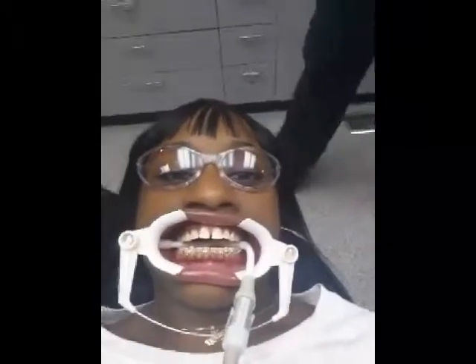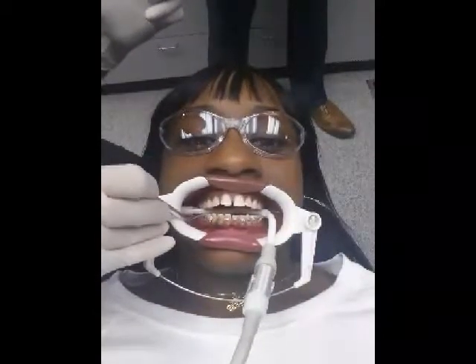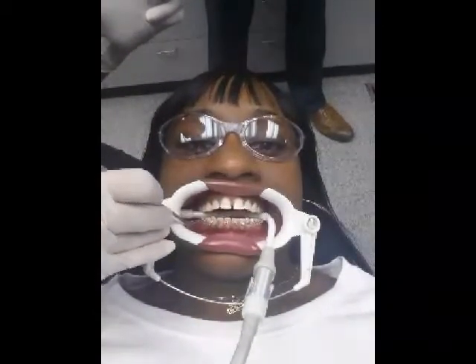And the orthodontist, who you saw for a minute, his shoes behind me, there he goes. He comes behind her and just checks and sees that they're positioned in the area of the tooth that he wants it to be positioned so that it can align right.